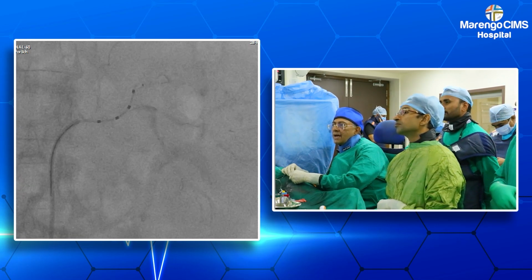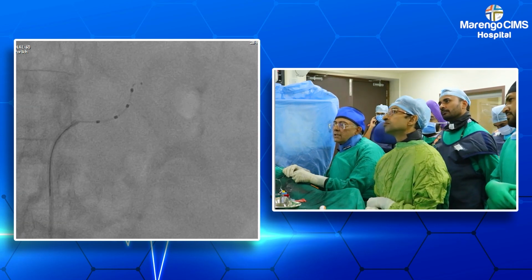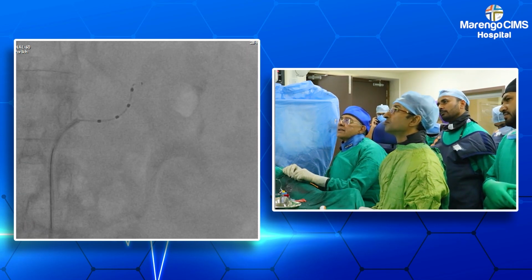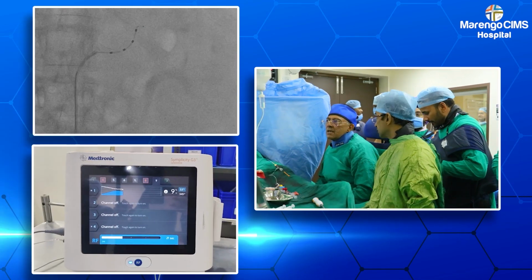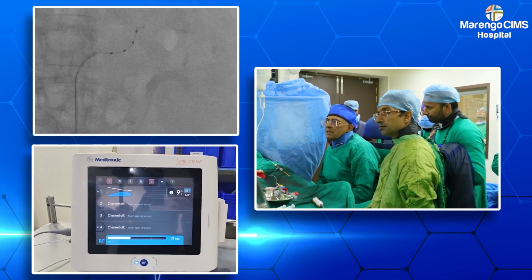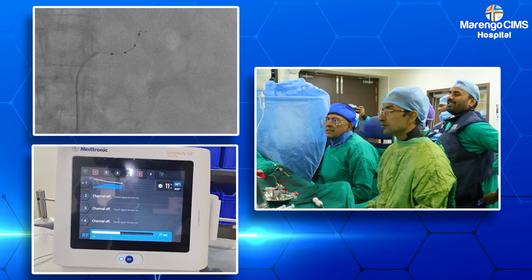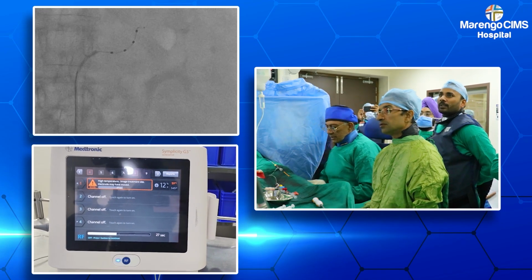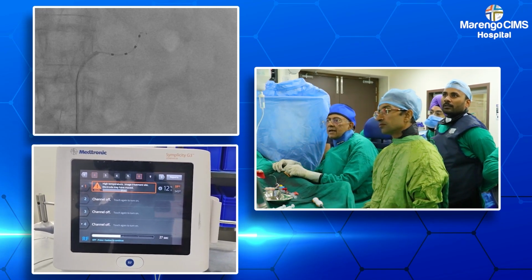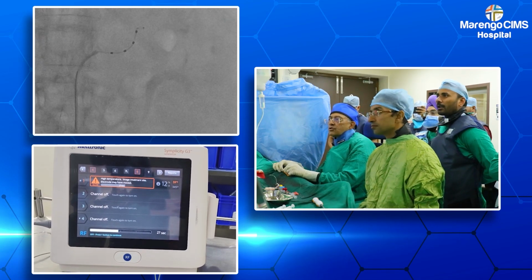So we'll position now into the main renal artery and make a decision whether to go into the superior artery and get it over first, which we can do. So we are now ablating with a single electrode into that superior branch. High temperature. So it's high temperature, it is shut off at about 27 seconds, and I think we'll not be pursuing that anymore.